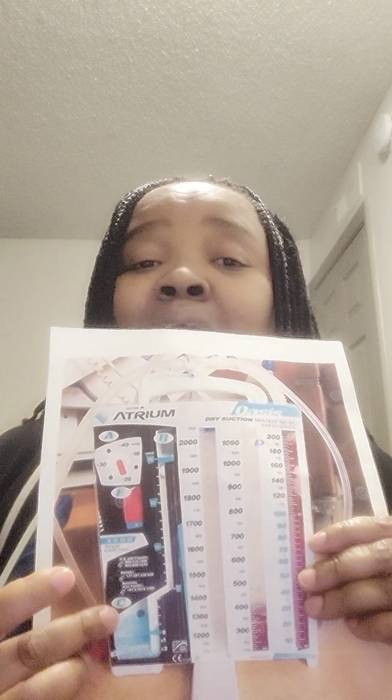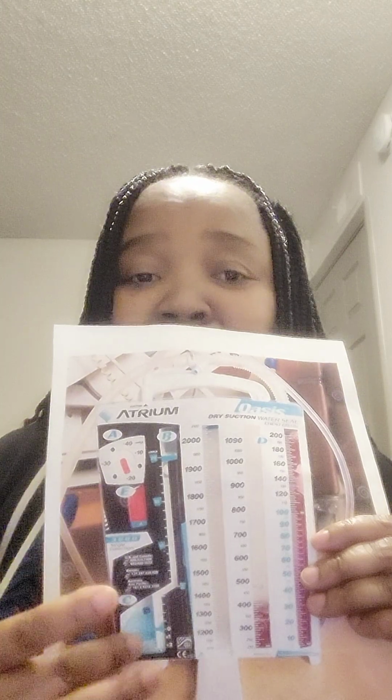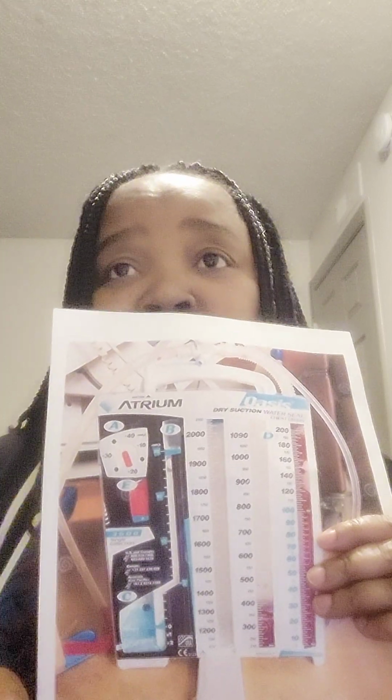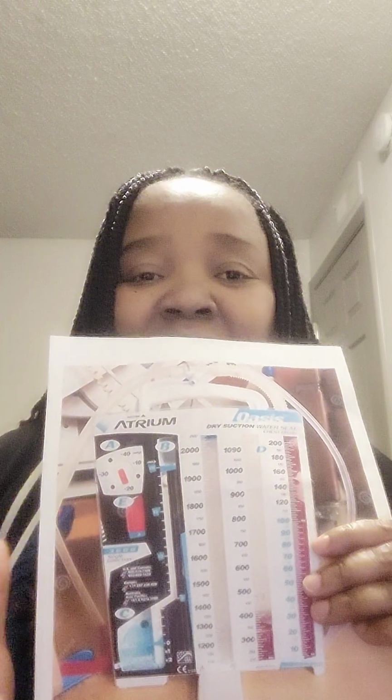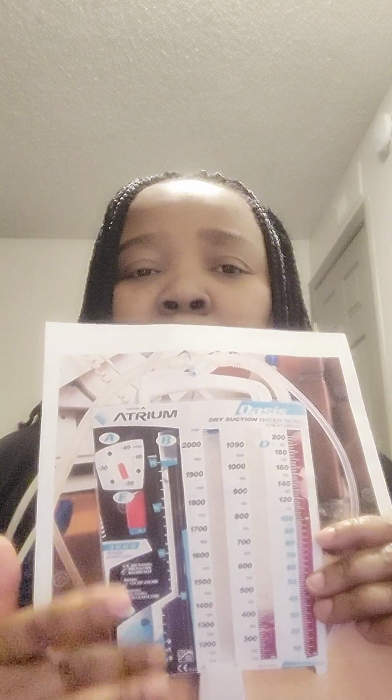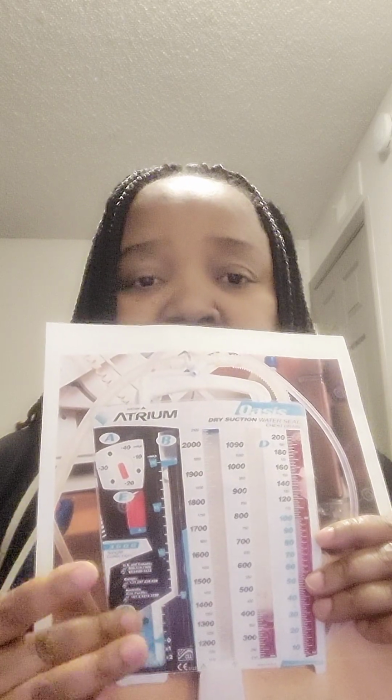Because if the idea is to remove air from the patient and nothing is happening here, that means that air is not coming out and maybe the catheter is kinked or is malpositioned or is obstructed. So take note of the difference. What you should see here with pneumothorax is bubbling, continuous bubbling, or at least increased bubbling.